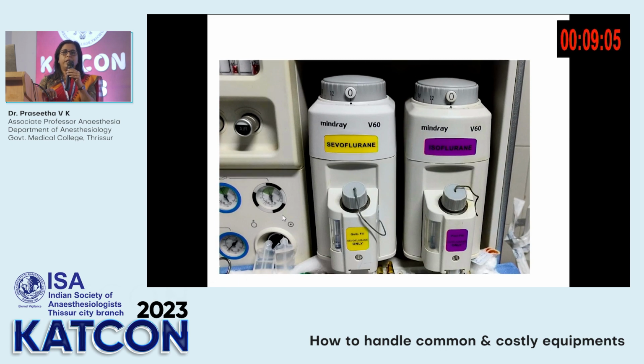You have to check for the drainage system, and one of the major problems when you're improperly mounting a vaporizer is a leak from the machine. So you will start anesthetizing a patient and you know that you have done a machine check, but somebody mounted a vaporizer after your machine check. So you are starting to give GA, the bag doesn't fill, you are not able to ventilate the patient. This has happened innumerable times. And when you check back, it is the vaporizer which is leaking.